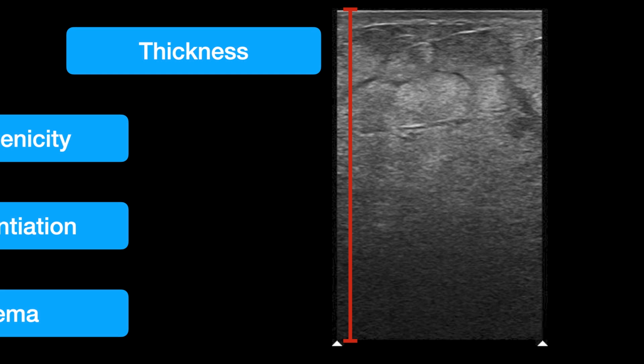And I encourage you, the next time you actually go scan, normally we don't think about it. We just put the probe down, look, it's inflamed and there's no abscess there, and we don't look at the surrounding tissue. Go scan down to normal, scan into the abnormal, scan back up to normal on the other side of things.